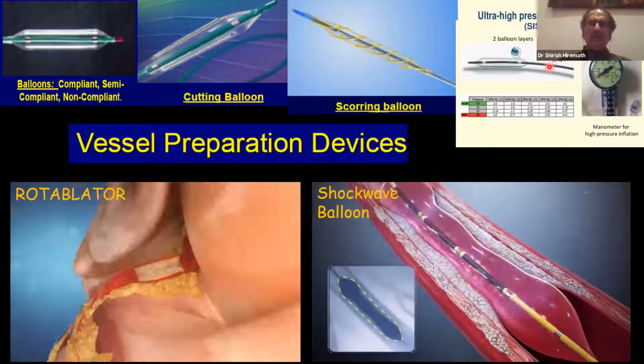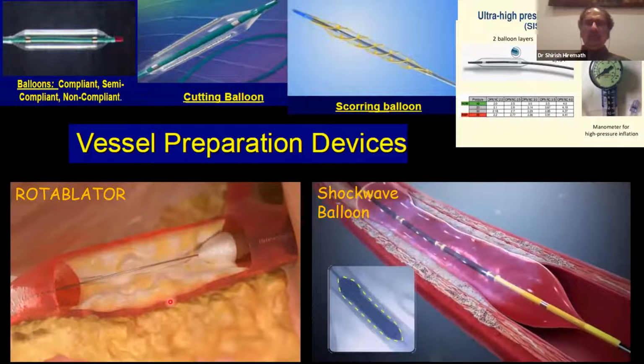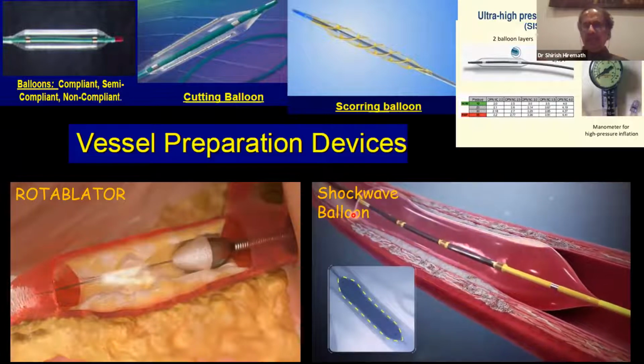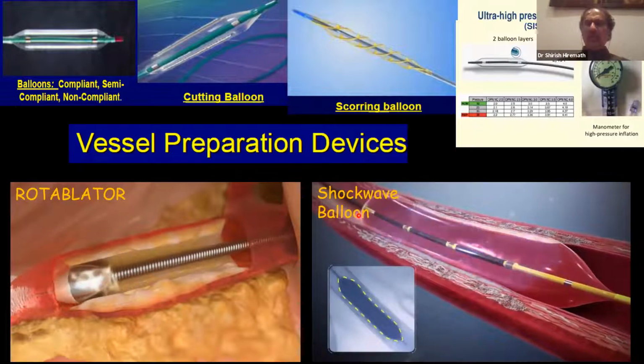Now we have this rotablator, which many of you must have used. This is there for almost 2 decades. But we also now have this shock wave balloon. I think if you see the technique, this is a little bit more user-friendly.